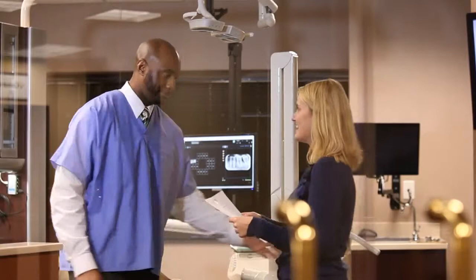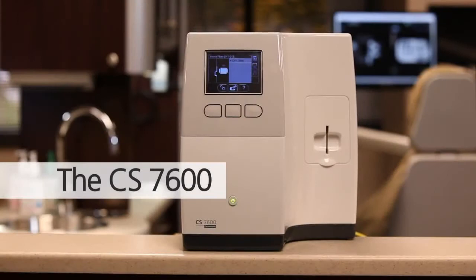With the ability to move from patient to patient more efficiently, the CS7600 will offer your team an improved workflow and your patients a faster office visit.